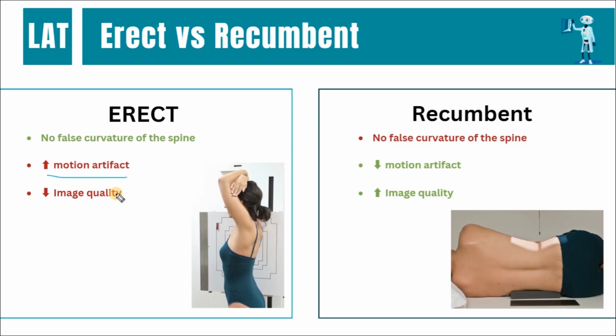There is also a slight decrease in the image quality due to the distance between the patient and the image receptor. So if you're doing the lateral position in the upright, make sure the patient is as close as possible to the image receptor.